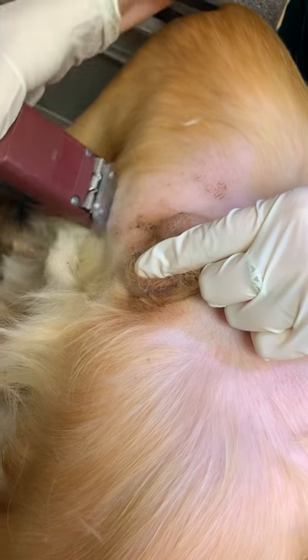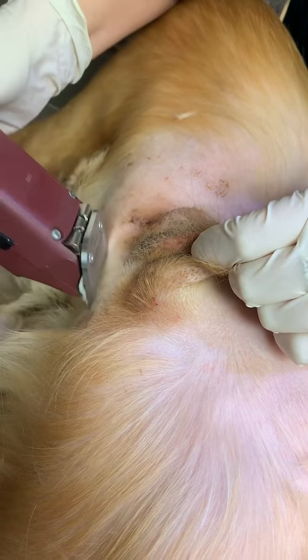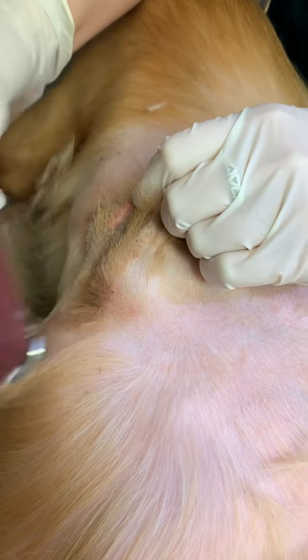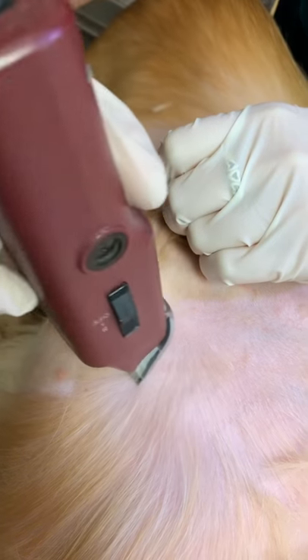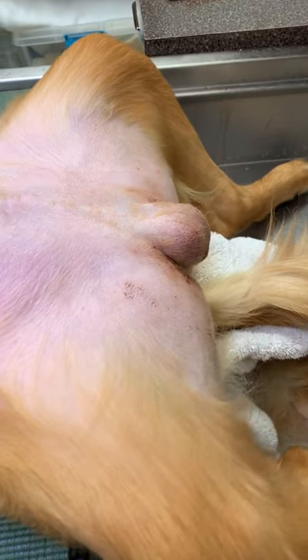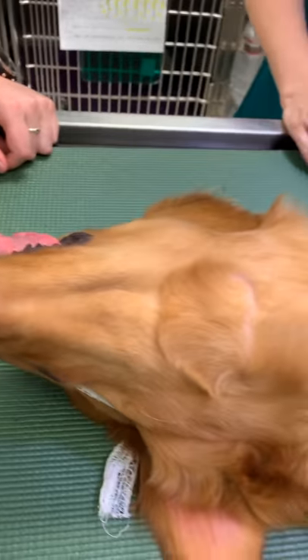So now we are preparing his neuter site by clipping all the hair around it off. And then after that's done, we'll be cleaning it and preparing it for a sterile procedure. Now that we've clipped the area, we are going to move the patient over to the surgery room so that we can prepare for his procedure.